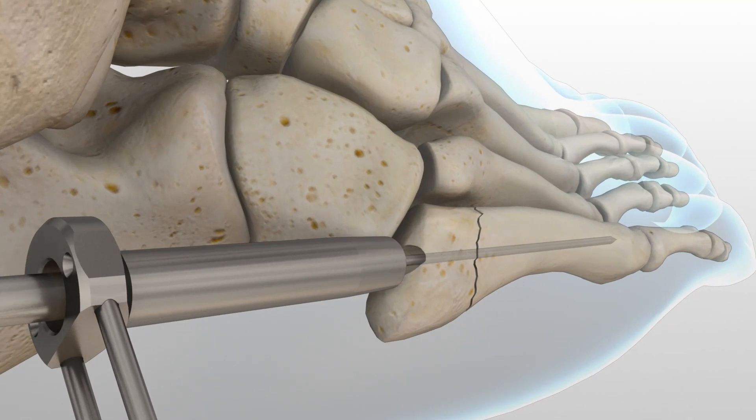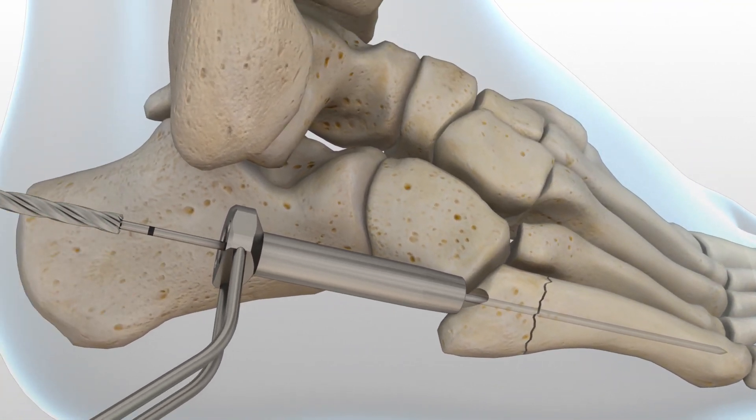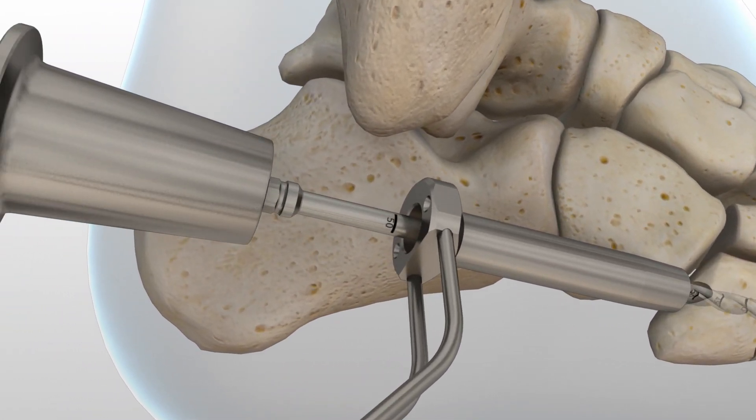Leaving the soft tissue guide in place, drill into the far fragment with the appropriate cannulated long drill to the appropriate depth. Reference the markings on the drill to confirm desired depth.